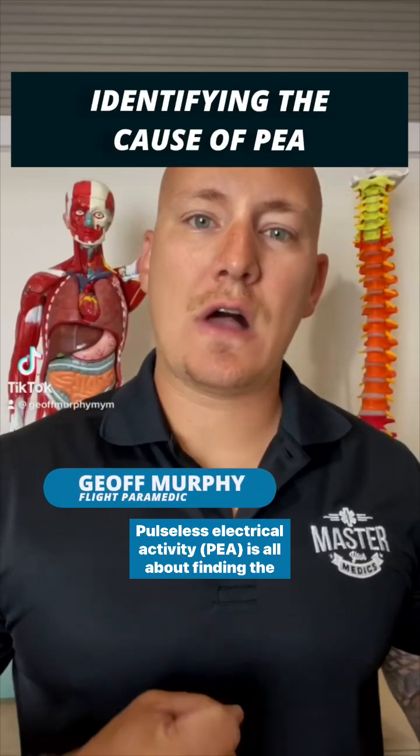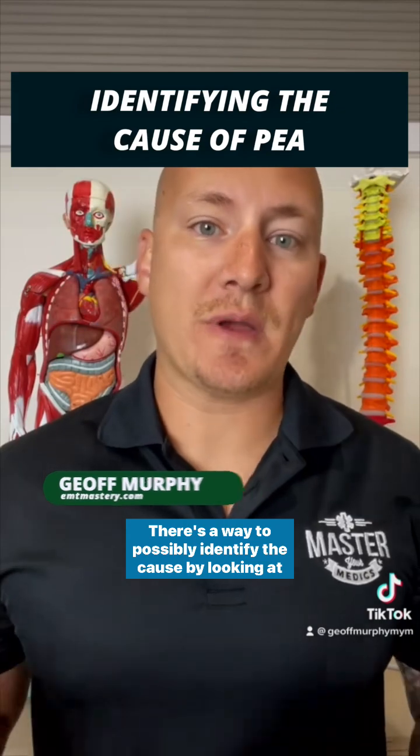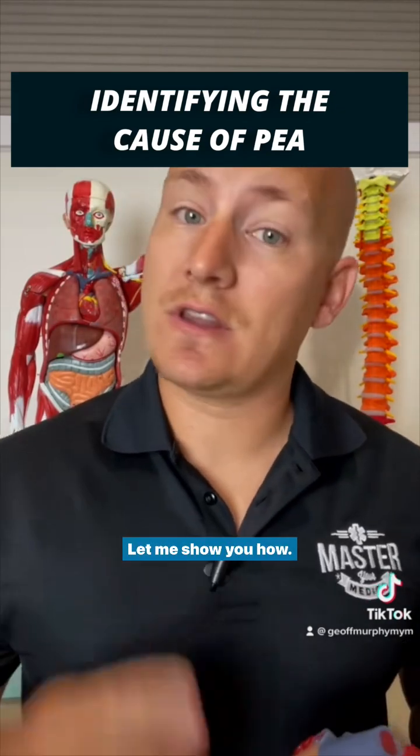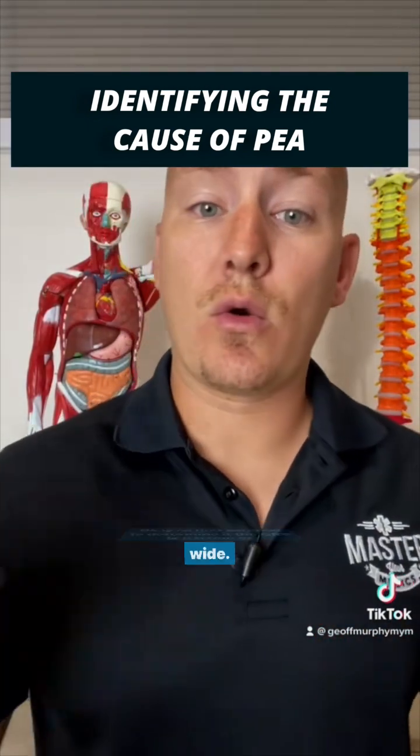Pulseless electrical activity is all about finding the cause and treating it. And there's a way to possibly identify the cause by looking at the ECG's QRS. Let me show you how. Okay, so first we need to determine if the QRS is narrow or wide.